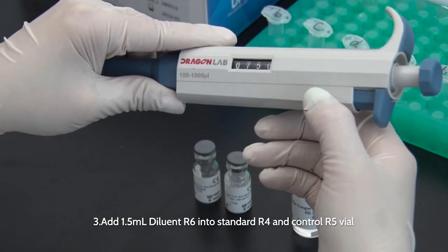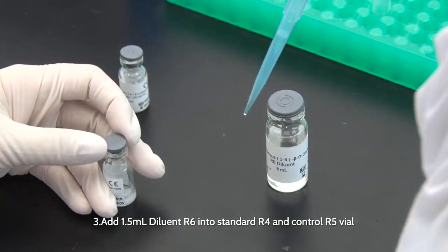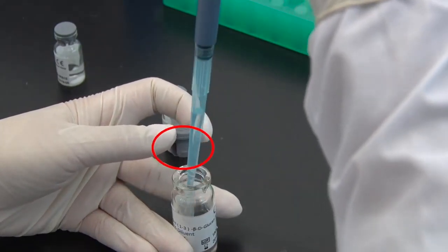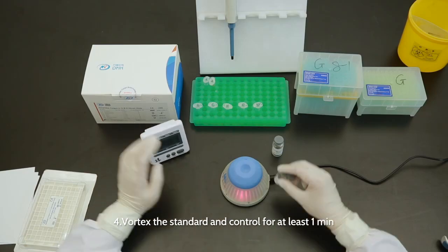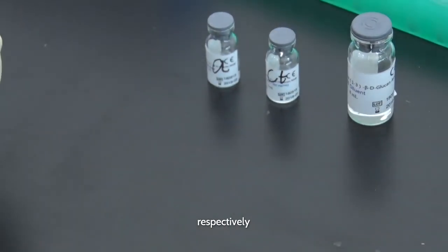3. Add 1.5 ml dilute R6 into the standard R4 and control R5 vials, respectively. Note: do not touch the inside of the rubber cap during the operation to avoid contamination. 4. Vortex the standard and control for at least 1 minute. Then label with standard A and control, respectively.